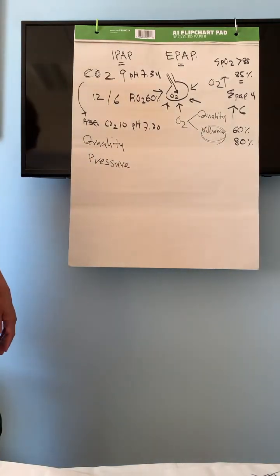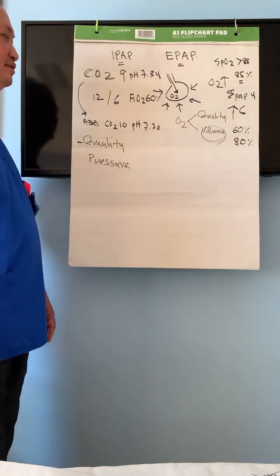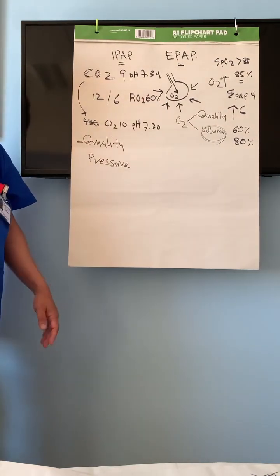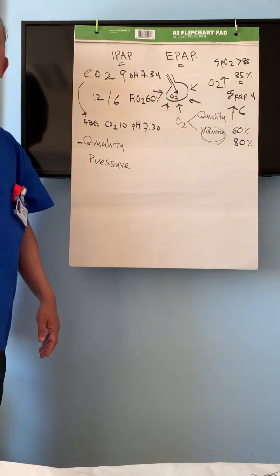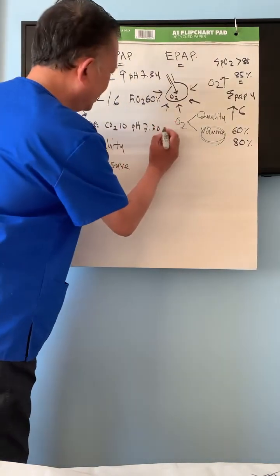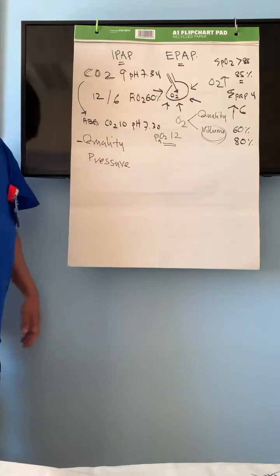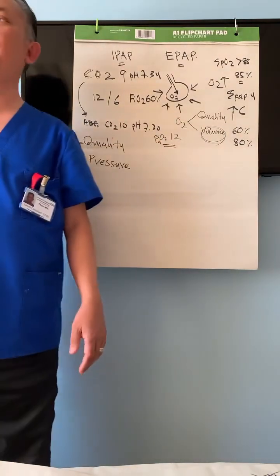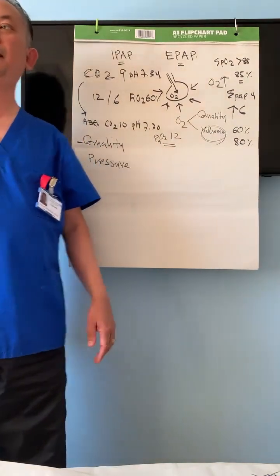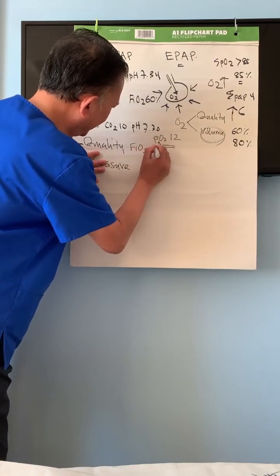Before you start the adjustment, check the quality. Are we giving too much oxygen, causing the patient to retain carbon dioxide? Yes, of course, you are giving FiO2 60%, which could be too much for your patient. How can we know that? In the ABG, PaO2 shows 12. Of course, we don't need 12; we only want 8. You are giving too much oxygen, proved by the PaO2 of 12. So what to do? Reduce FiO2 to 40%.